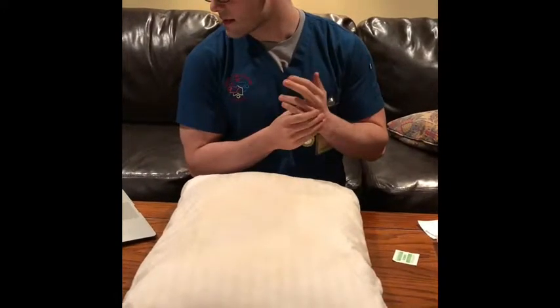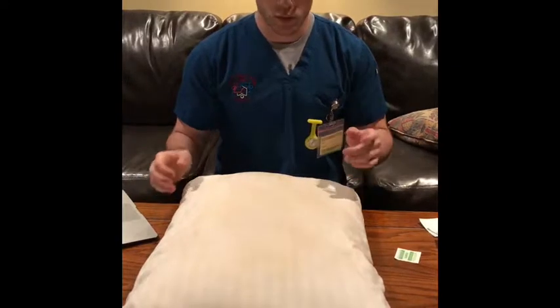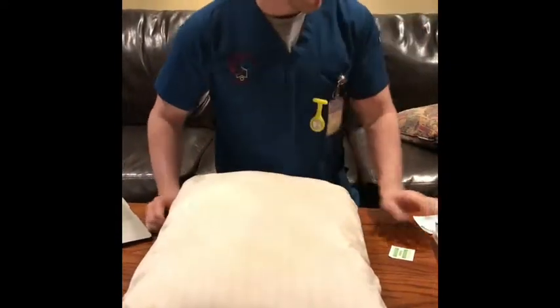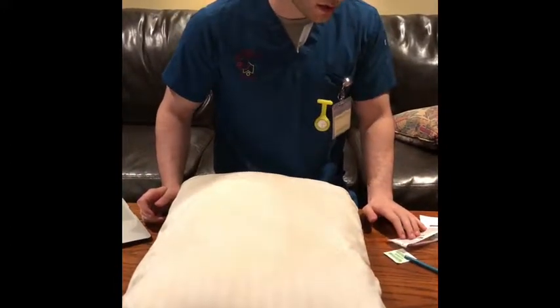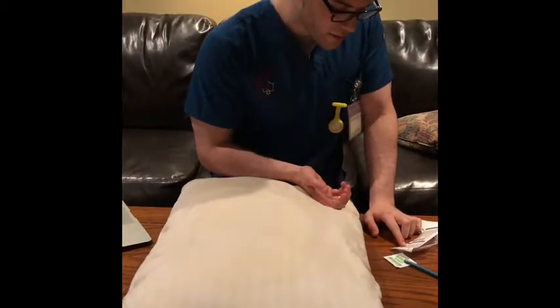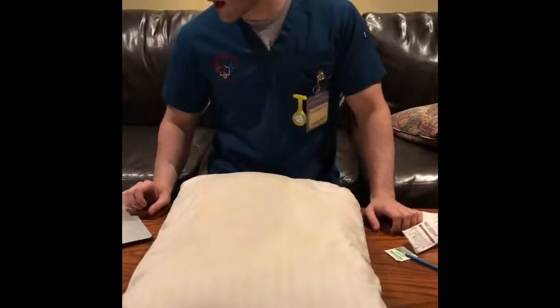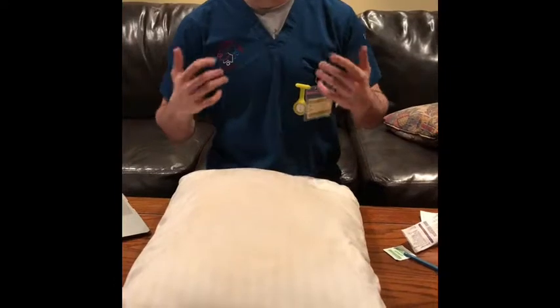And then once that is done and ready to go, we will enter the room and we will examine the patient and ensure that this is the right patient one more time. So by comparing what I've written on the medication, Mr. Mancini, and then checking the patient's wristband, Mr. Mancini, yep, 100%.